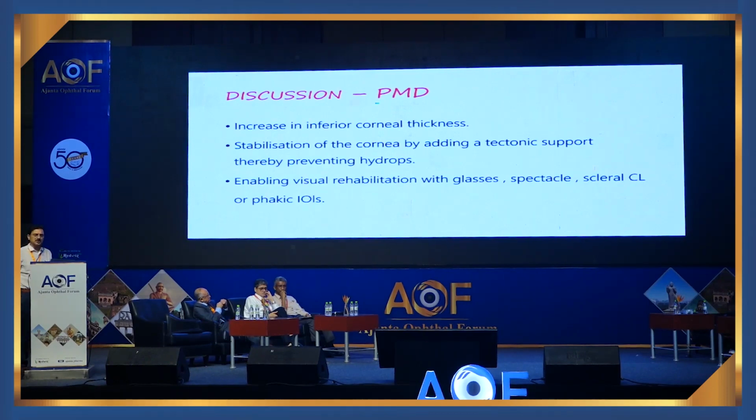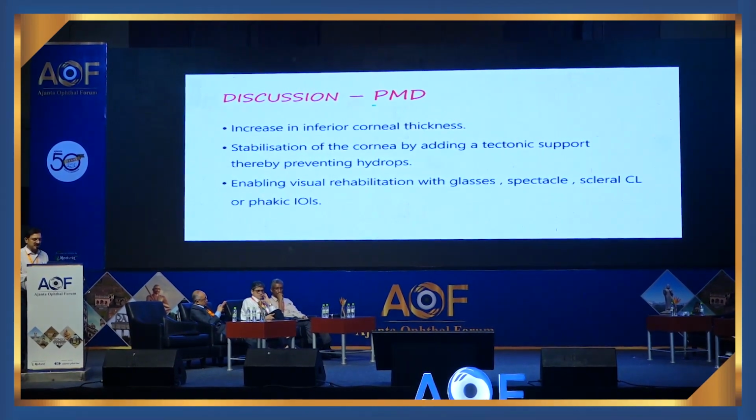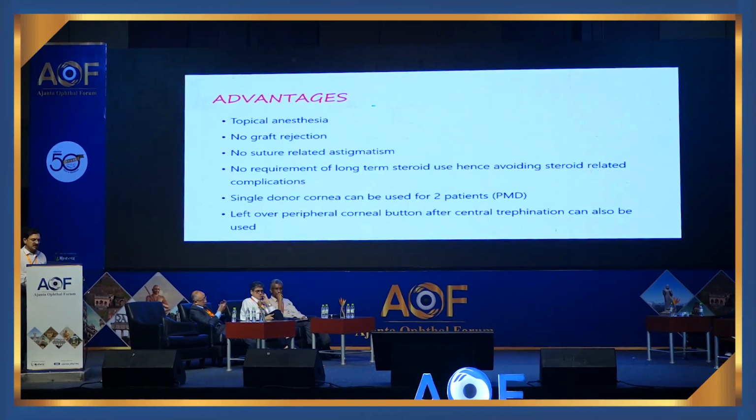PMD is a very slowly progressive condition, unlike keratoconus, and the residual astigmatism is also very good. Even 10-15 diopters we can do customized phakic IOLs and implant, and they do very well. The advantage: just a topical, no graft rejections, no suture-related astigmatism, and no requirement of long-term steroids. And a single donor can be used, or leftover cornea from DMEK, the leftover pieces can be used here in this case.